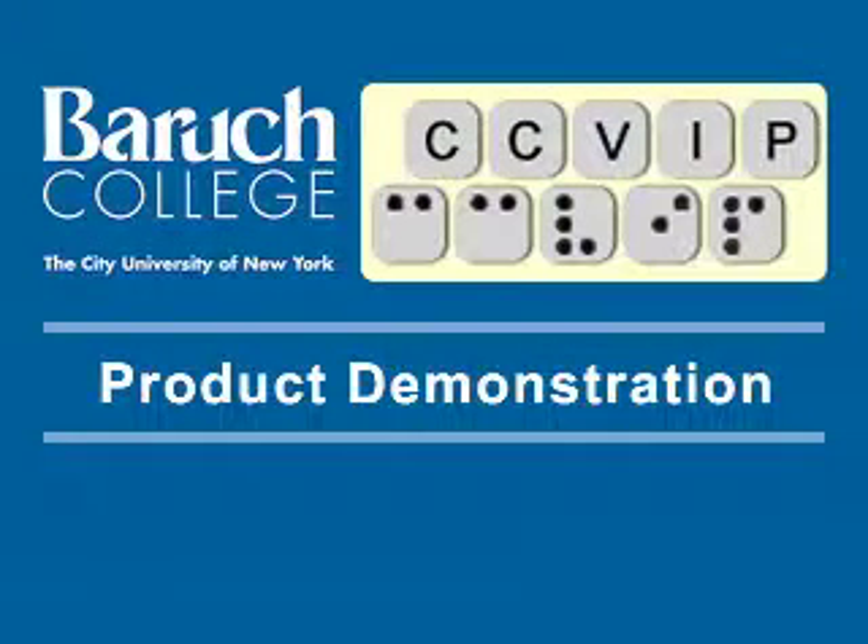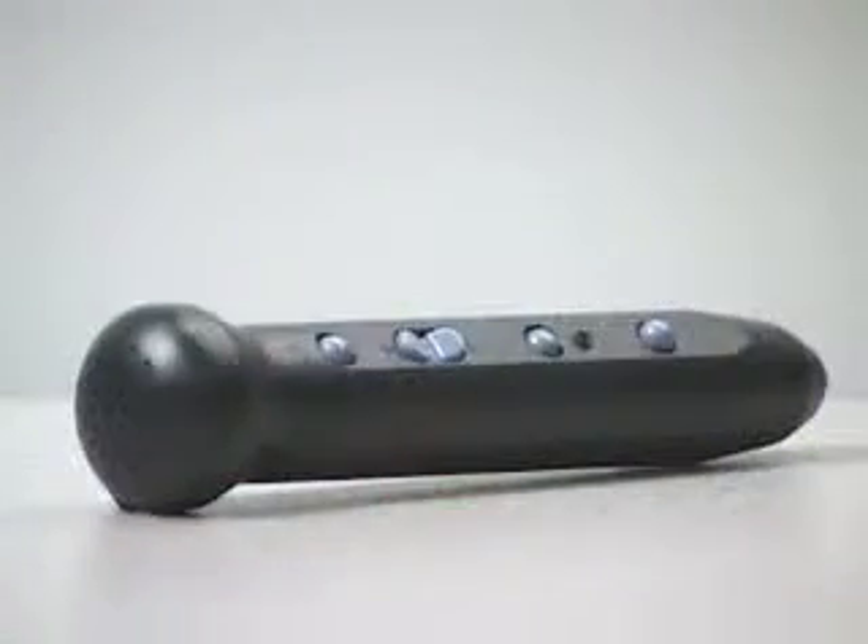The Computer Center for Visually Impaired People at Baruch College, City University of New York, product demonstration. Welcome, and we're back today with another technology demonstration. Today we'll be talking about the Pen Friend, which is a labeling system that was created by the Royal National Institute for the Blind in the UK.